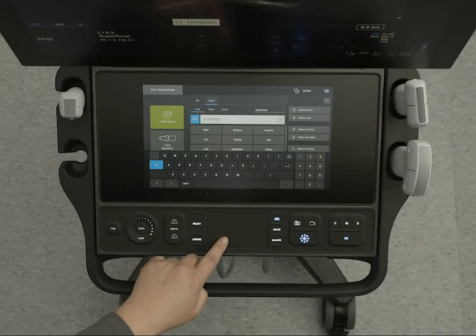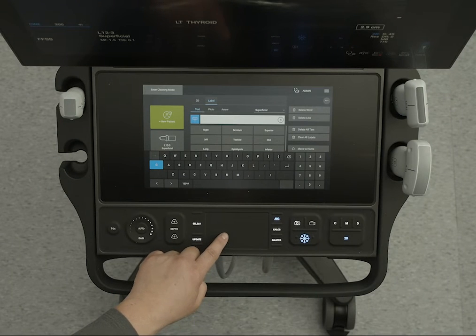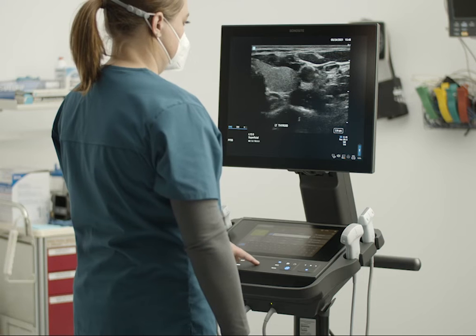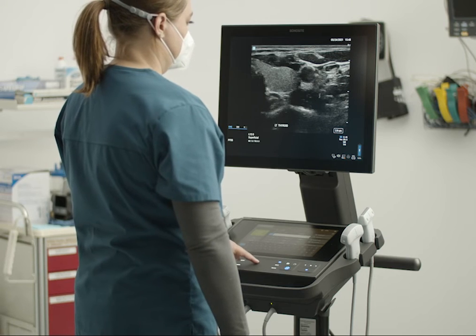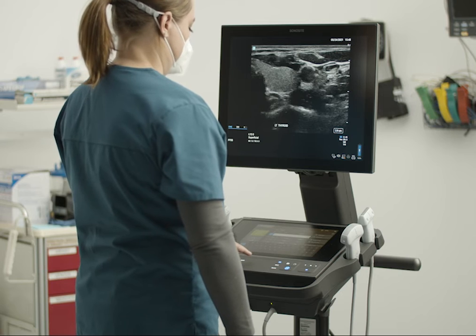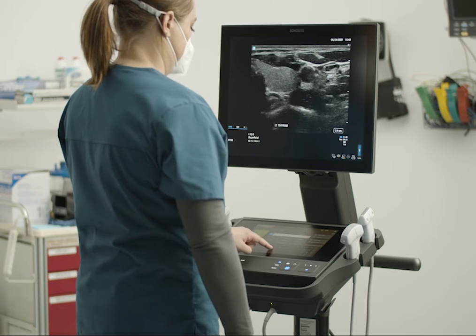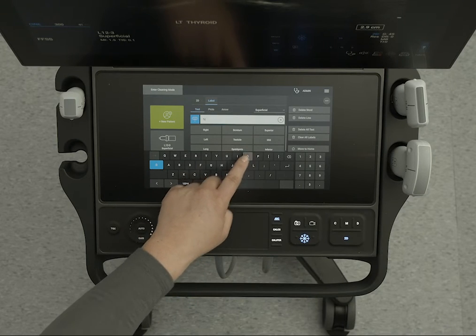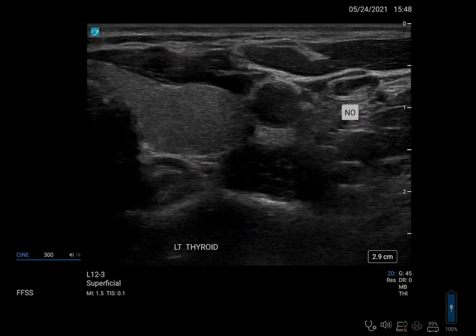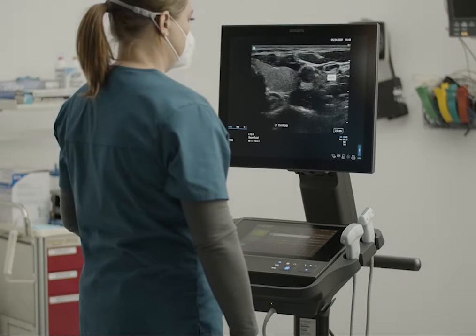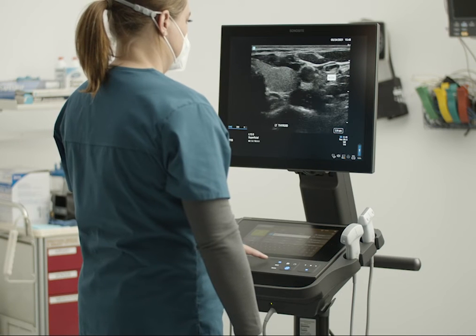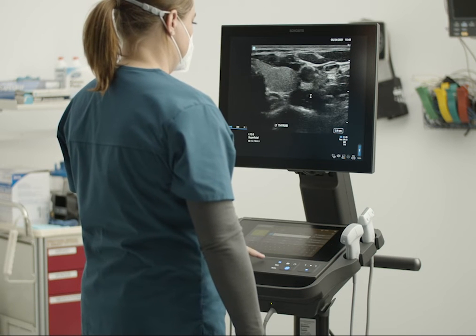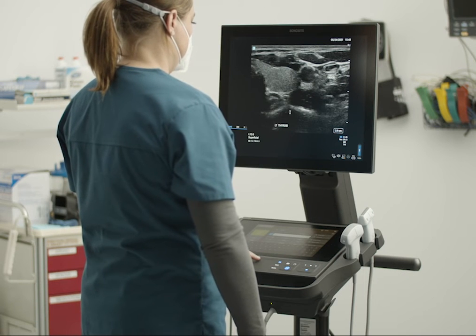Let's enter another label. You'll need to move the cursor to another location on the monitor using the touchpad. Tap the keyboard in the text box and type in another label. You can edit, move, and delete any of your labels.